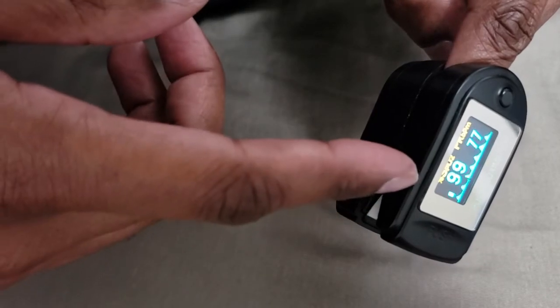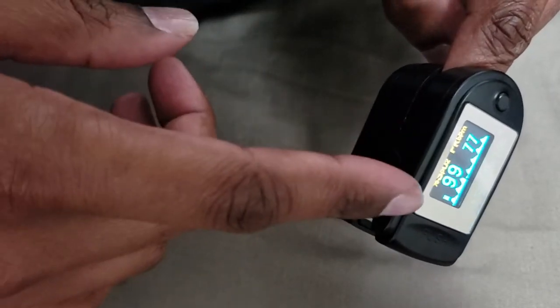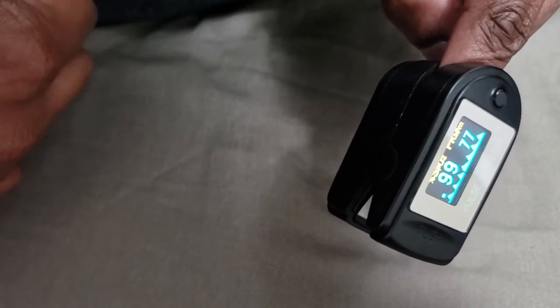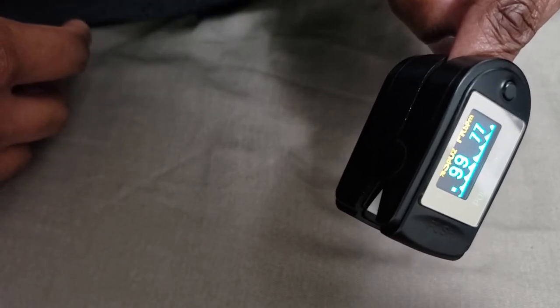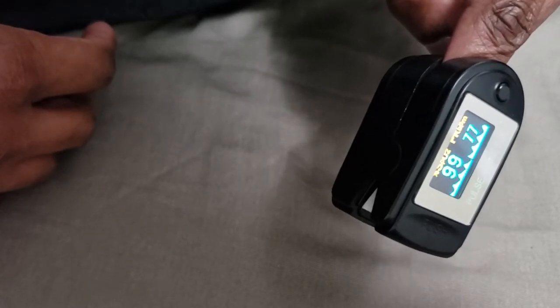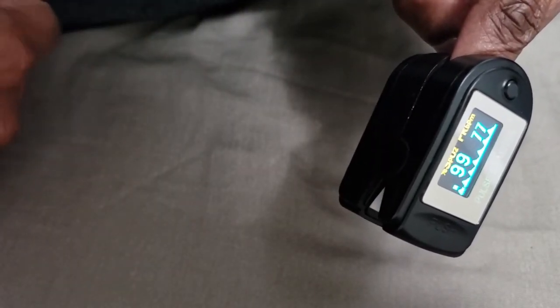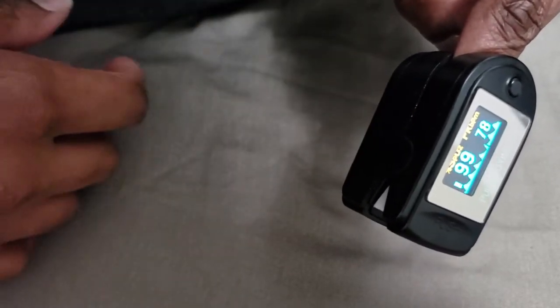And I want to make sure before I get sick that I understand my baseline. Usually it's 99. If I have something like COPD or some kind of lung issue where I usually don't have full lung capacity, my baseline might be something lower, like 96 or 97, where it's not 99. And so I want to know what that baseline is before I get sick. I want to know what my regular number is. And for me, it's 99.